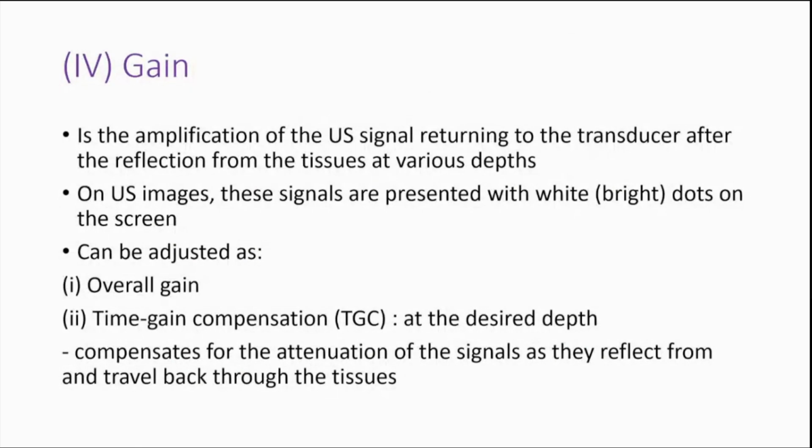Next will be the gain, which is simply defined as the amplification of the ultrasound signal which returns to the transducer after reflection from the tissues at varying depths. On the images, these signals are present as white or bright dots on the screen, and they can be adjusted as overall gain or time gain compensation at desired depth. This helps to compensate for the loss of the signals as they are reflected and travel back through the tissues.